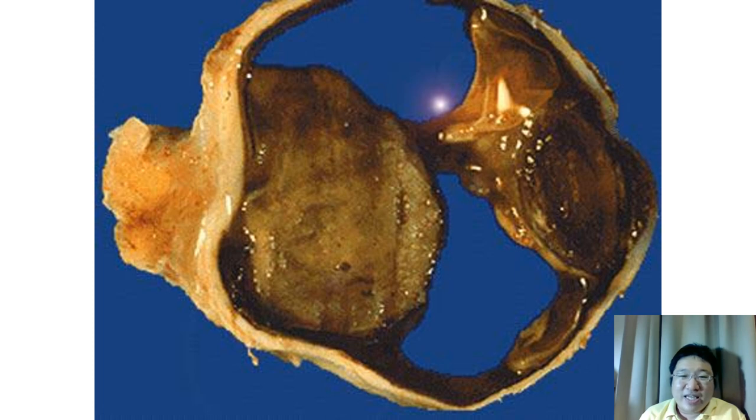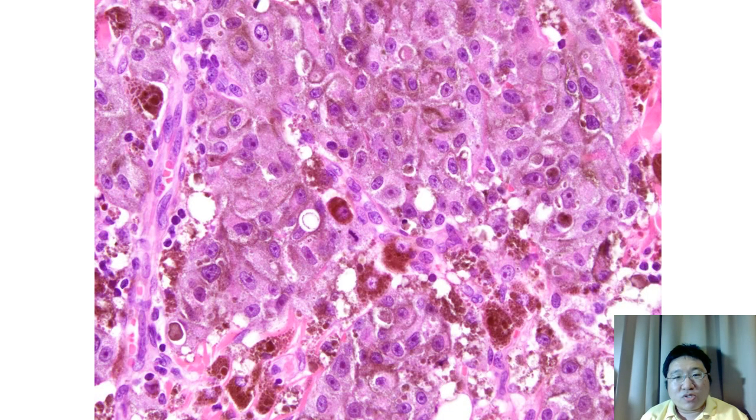And if you see a tumor in the eye, if the age is in the adult range, that is melanoma, right? If you see any black mass in the body, just suspect that it may be melanoma. It arises from the uvea. The cells are highly anaplastic, and the cells produce melanin pigment. So this is melanoma of the eye.